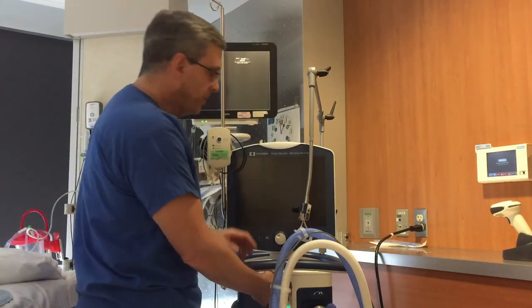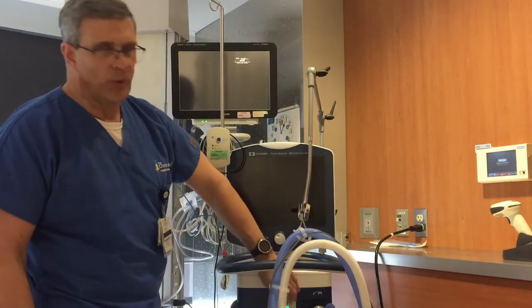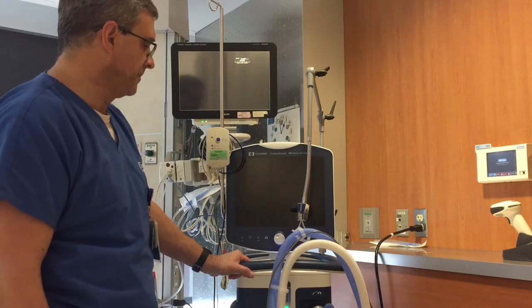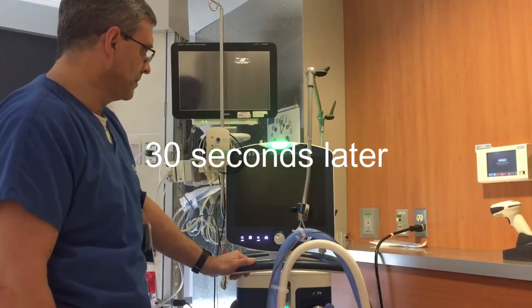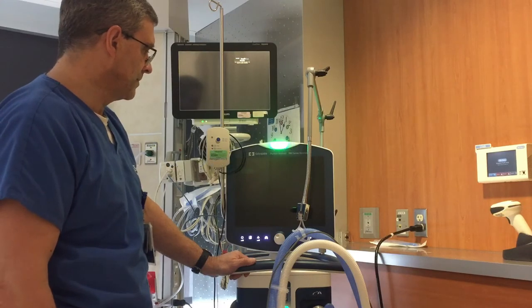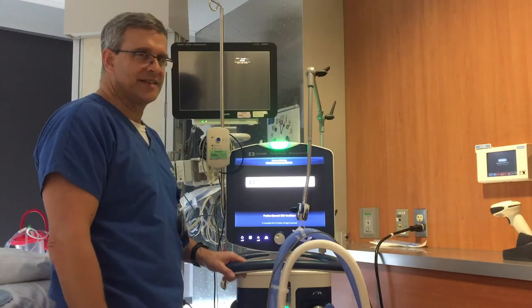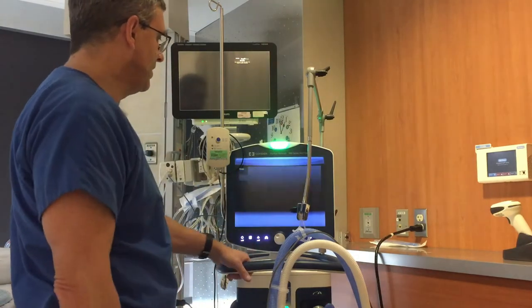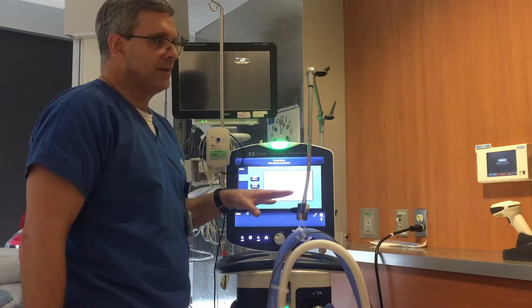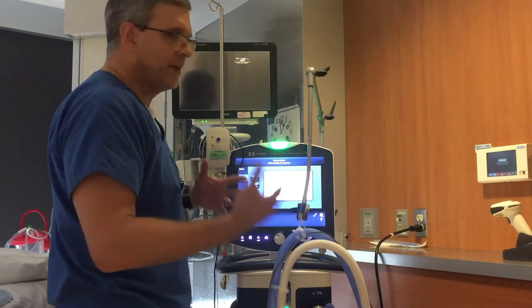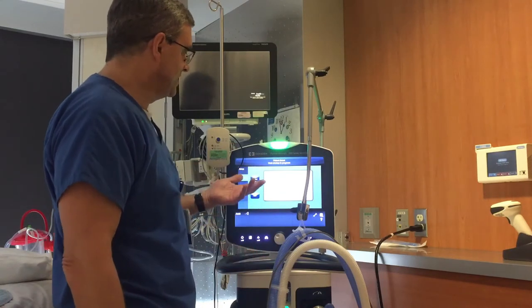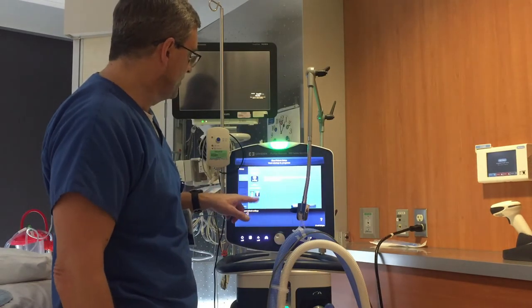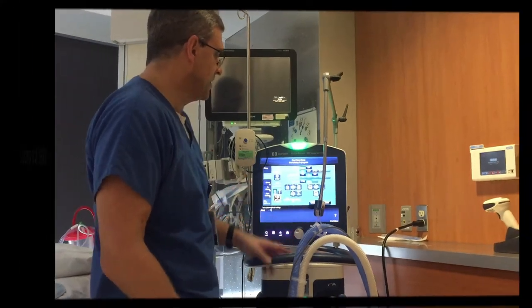We always turn the ventilator on before we hook it to the patient. There's always a door covering the on/off switch so it doesn't get bumped and turned off accidentally. If you know a patient is coming, it's sometimes easier to get it powered up so you don't have to wait for it to boot. Every ventilator is different, but they all have some type of basic setup function where you input the settings, and now I can input all the settings I want for the patient.